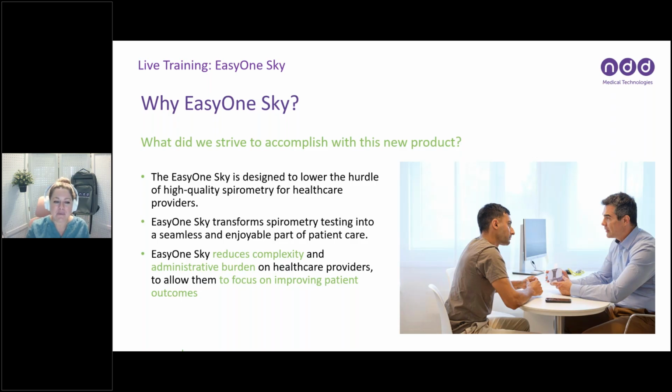The EasyOne Sky transforms spirometry testing into a seamless and enjoyable part of patient care. The EasyOne Sky reduces complexity and the administrative burden on healthcare providers, allowing them to focus on improving patient outcomes. We know when we do spirometry early or at first signs of symptoms, that early diagnosis is so key, especially in COPD and other lung disorders. So we want to try to improve patient outcomes whenever possible through this early diagnosis.